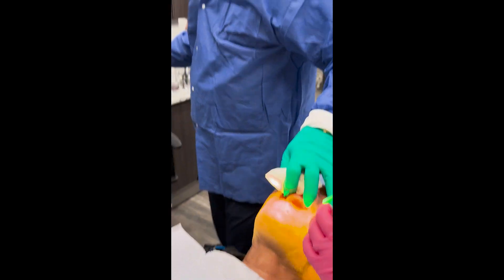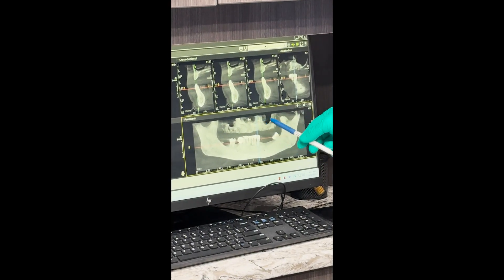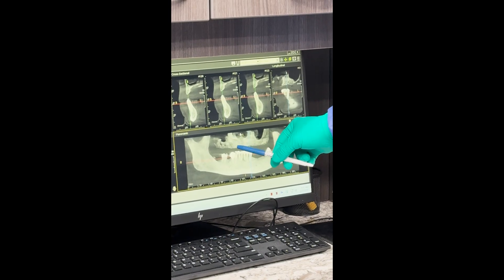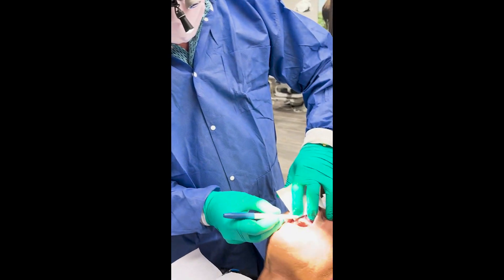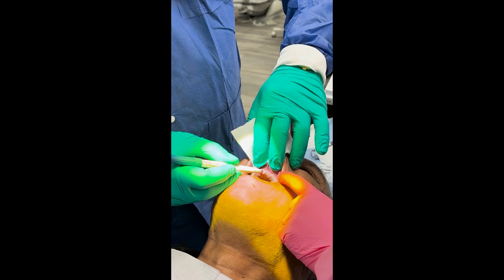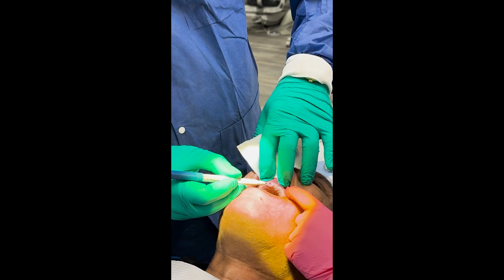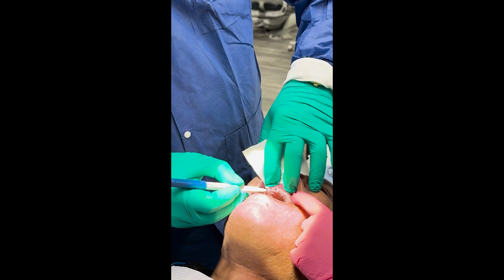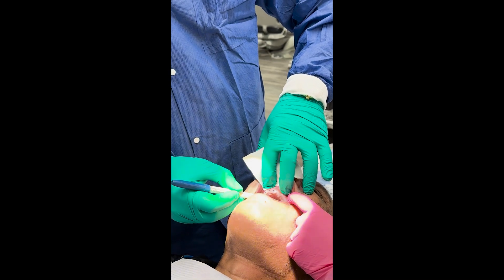If you look at the x-ray here, you'll see he has very low hanging sinuses in the posterior, so we only have room for 10 implants and we're going to stay anterior to the sinus area. We're going to put 2.5x11 millimeter implants. This was a last-minute case scheduled, so we didn't have time to make a surgical guide, but I'm going to go ahead and mark the locations of where I'm going to place the 10 implants.